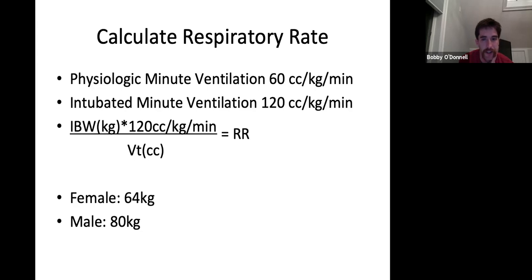Does that make sense? And that's really important because oftentimes patients will be hypoventilated. When we think of our ACLS and the advanced airway is placed, you're bagging them at 10 a minute, once every 6 seconds, whatever, that's fine as an adjunct. But then when you get them on the mechanical ventilator, they need to be achieving this adequate minute volume, and their respiratory rates are notoriously going to be 17, 18, 20, and that's okay because that's what their minute ventilation should be.